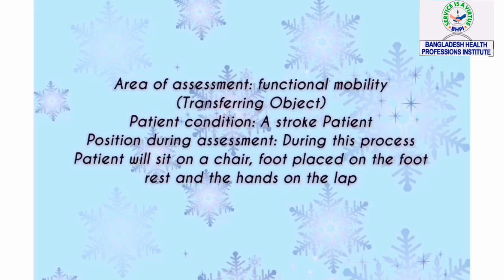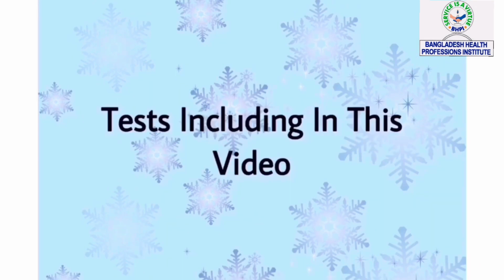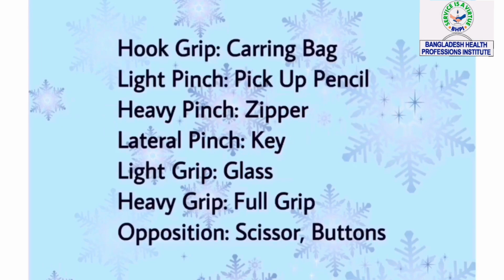During this process, the patient will sit on a chair, foot placed on the footrest and the hands on the lap. Tools: a bag, one pencil, zipper, key with lock, a glass, scissor and buttons. Tests included in this video: hook grip, light pinch, heavy pinch, lateral pinch, light grip, heavy grip and opposition.